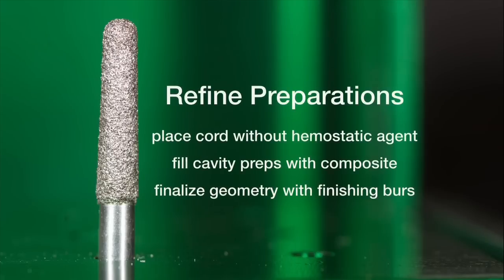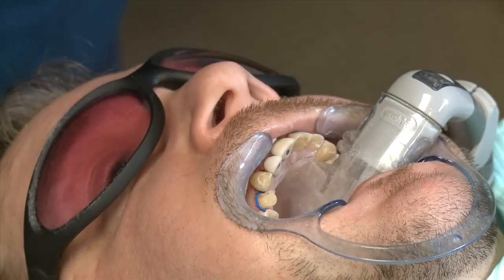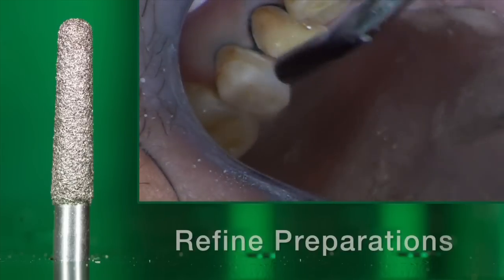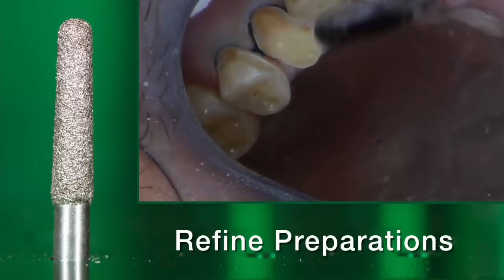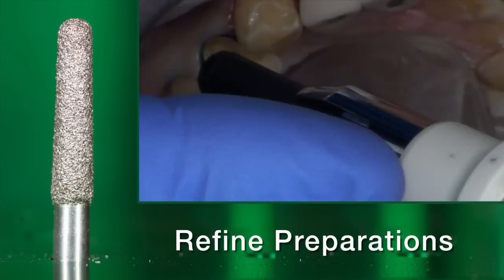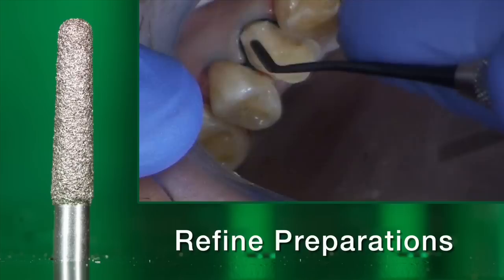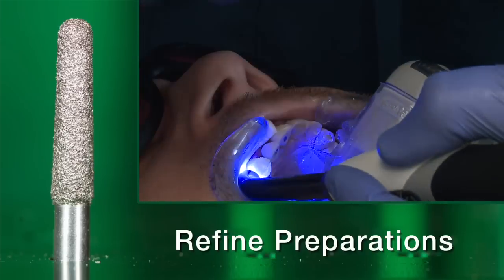Now that we've removed all the decay, let's go back and refine our preparation. I'm going to begin to work on my tissue control by placing some retraction cord. This cord does not have any hemostatic agent — it is a dry number one cord — and we're going to place that down in the sulcus of the crown prep and the adjacent tooth. We'll get those preparations clean and dry, then fill in those cavity preparations with some composite resin. It's important to use a composite resin with a shade equivalent to the prepped tooth shade. In this case, we've got A3 composite resin; once light cured, it will blend nicely with the preparation. We'll sculpt it in, light cure it, and then proceed to our final preparation refinement steps.